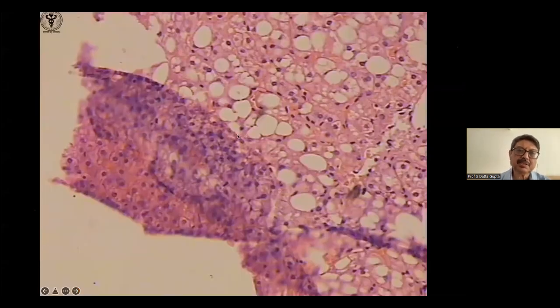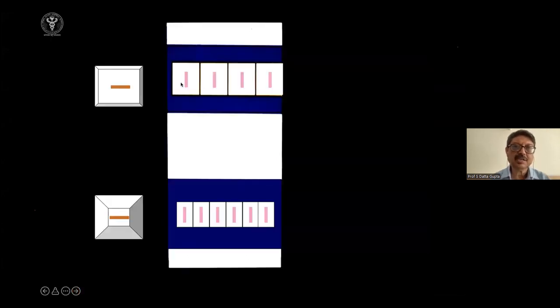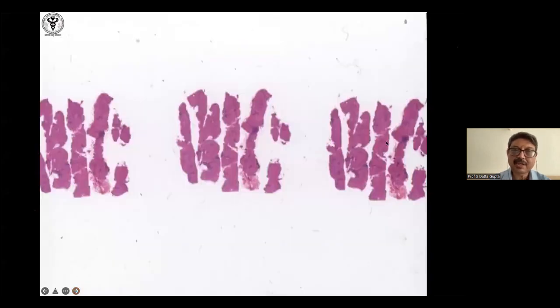The other technical aspect, of course, is folded and other sections that the technicians in the lab should be aware of. Do not try to squeeze the biopsy with forceps when you're trying to put it into a bottle. So these are artifacts that one has to remember. The liver biopsies are processed in paraffin. Generally, frozen sections are used for certain specific indications. And when you put it in paraffin, it shrinks in size by a few millimeters, so a little longer length would be helpful. And these are the multiple cores that you see.